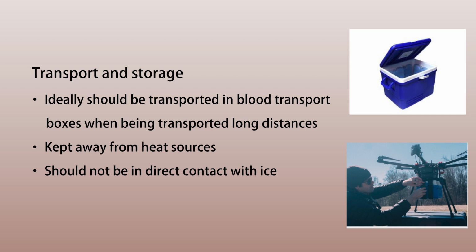So ideally always transport them in transport boxes and keep away from the heat resources. And also when you keep inside the box, make sure that the blood is not in direct contact with the ice. So you have to arrange the ice packets around the box inside it, and probably keep a gauze or a cloth or something so that blood is not in direct touch with the ice.